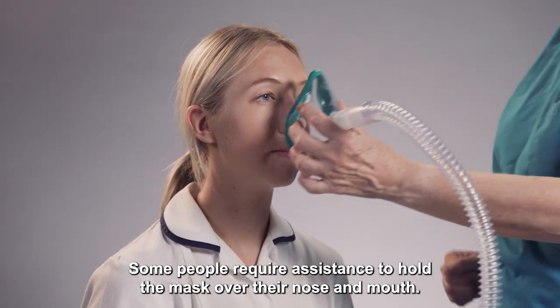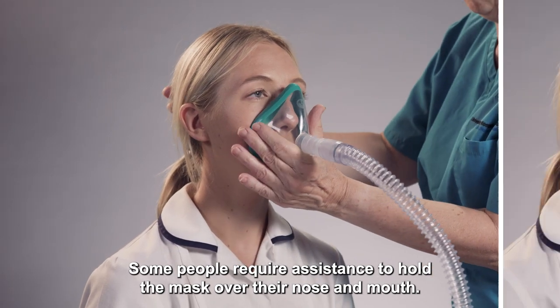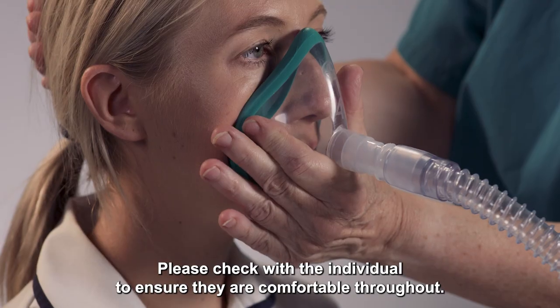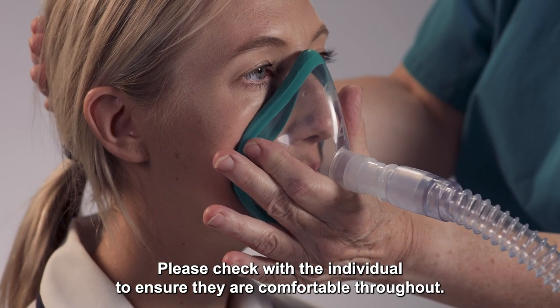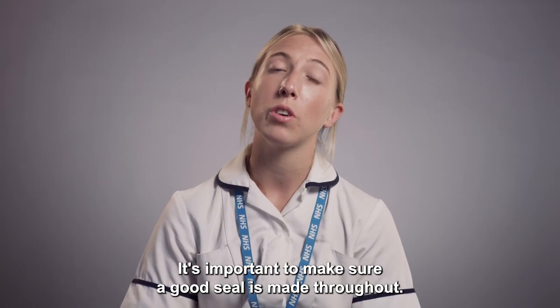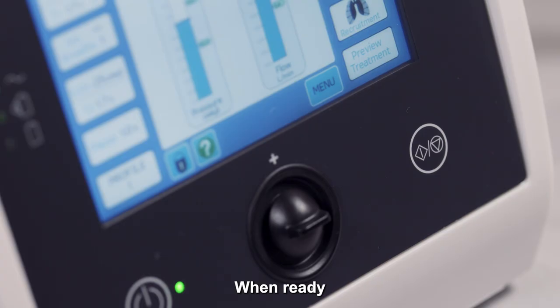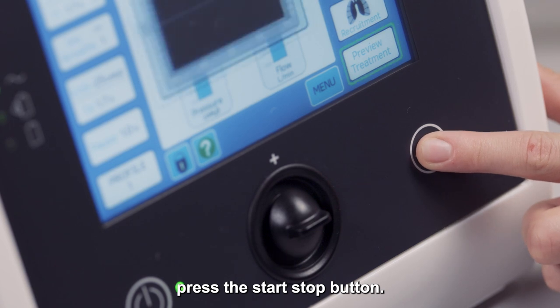Some people require assistance to hold the mask over their nose and mouth; others may be able to do it themselves. Please check with the individual to ensure they are comfortable throughout. It's important to make sure a good seal is made throughout — this can be done by creating a C shape with your hand. When ready, press the Start Stop button.